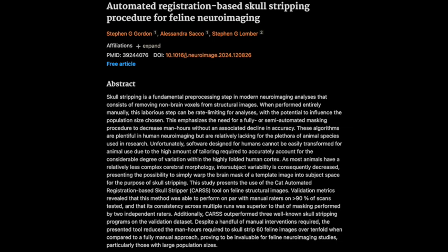You've got it. And again, the researchers found that CARS performed exceptionally well on this metric too. They even looked at the 99th percentile of the Hausdorff distance, which basically helps to smooth out any tiny, insignificant variations. So they're really putting CARS through the ringer, making sure it's accurate and consistent.